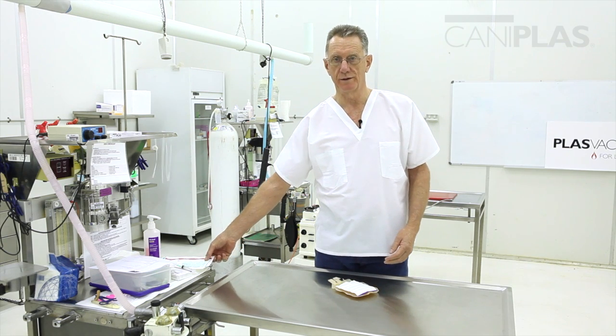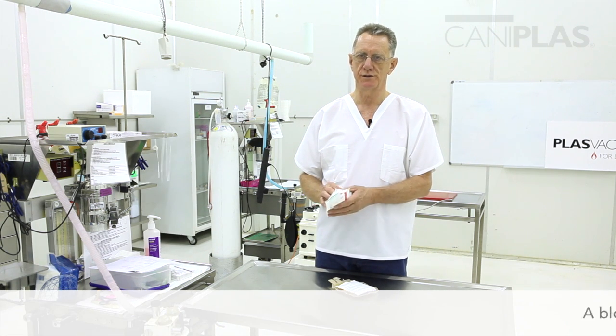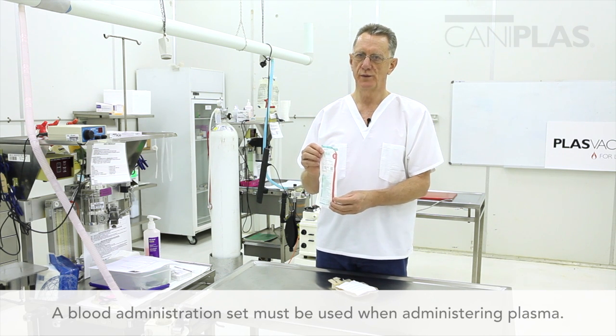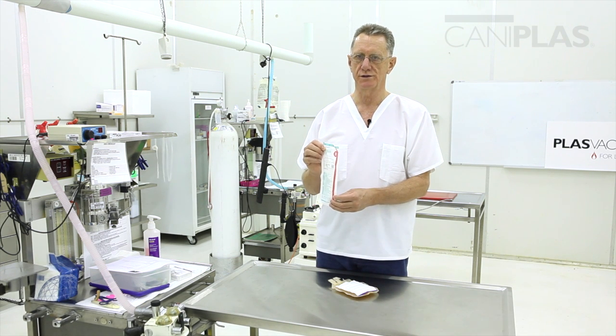Now we get our blood administration set. You will have read from the label that a blood administration set must be used when you're administering plasma. We use the Sangofix ES, made by Braun, but there are others — as long as it's a blood administration set.